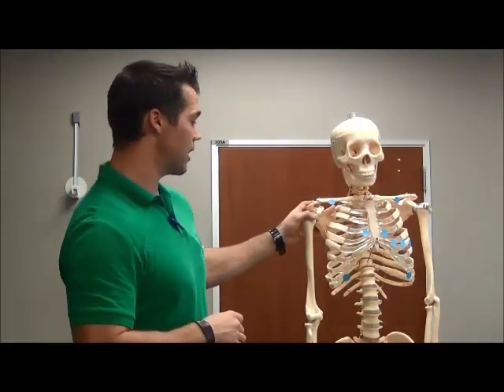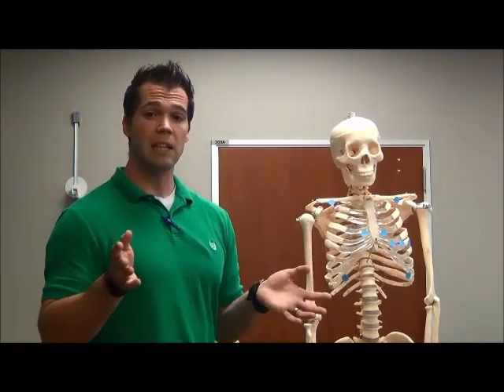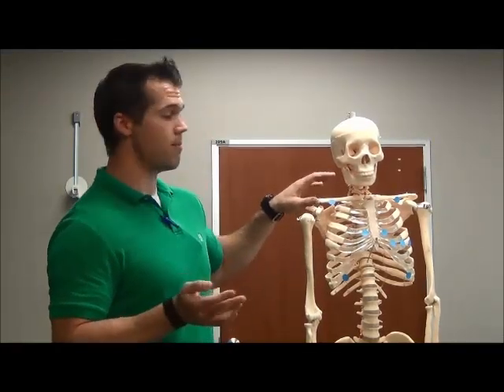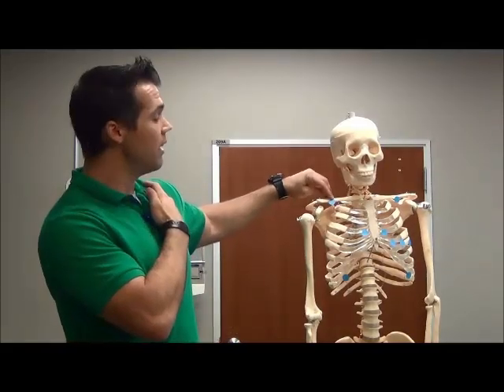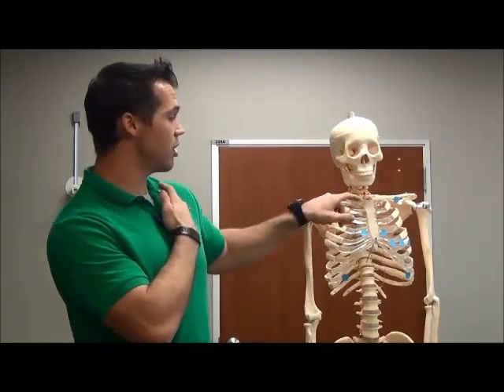I'm going to briefly talk about where these electrodes go. So you have the limb leads. They're called the limb leads, and you don't actually place them on the limb. You place the right one, called the right arm, right under the clavicle. The left one, called the left arm, is right under the left clavicle. So those are your two arm leads.